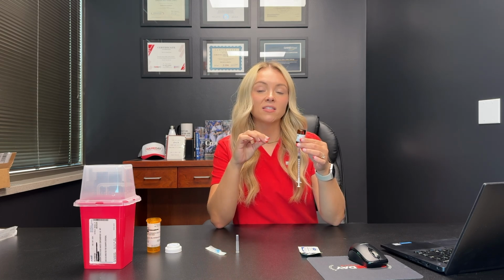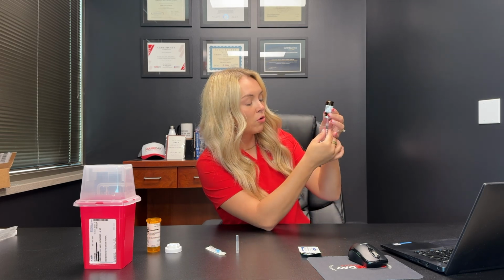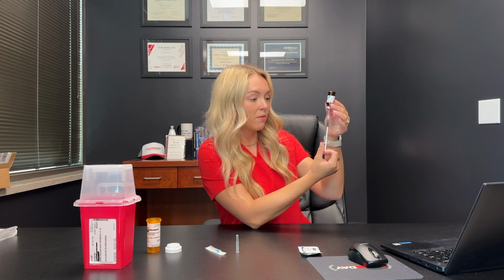Right now, the tip of my needle is past the medication and into the air in the vial. If I were to pull the plunger back now, I would just draw back air. So very carefully, I'm going to pull the needle and the syringe down until I can see that they are below the line, or the level, of the medication, so that it's firmly in the medication. Next, I'm going to take my syringe and pull the plunger down slowly until I hit 0.4 mLs.